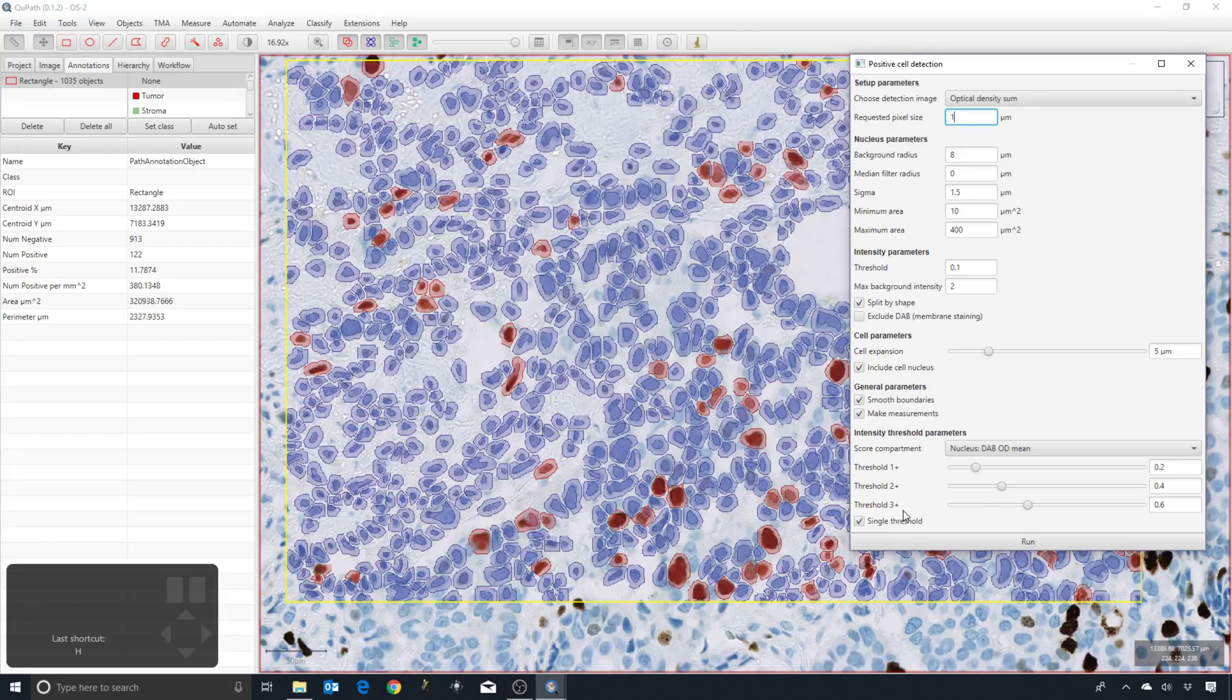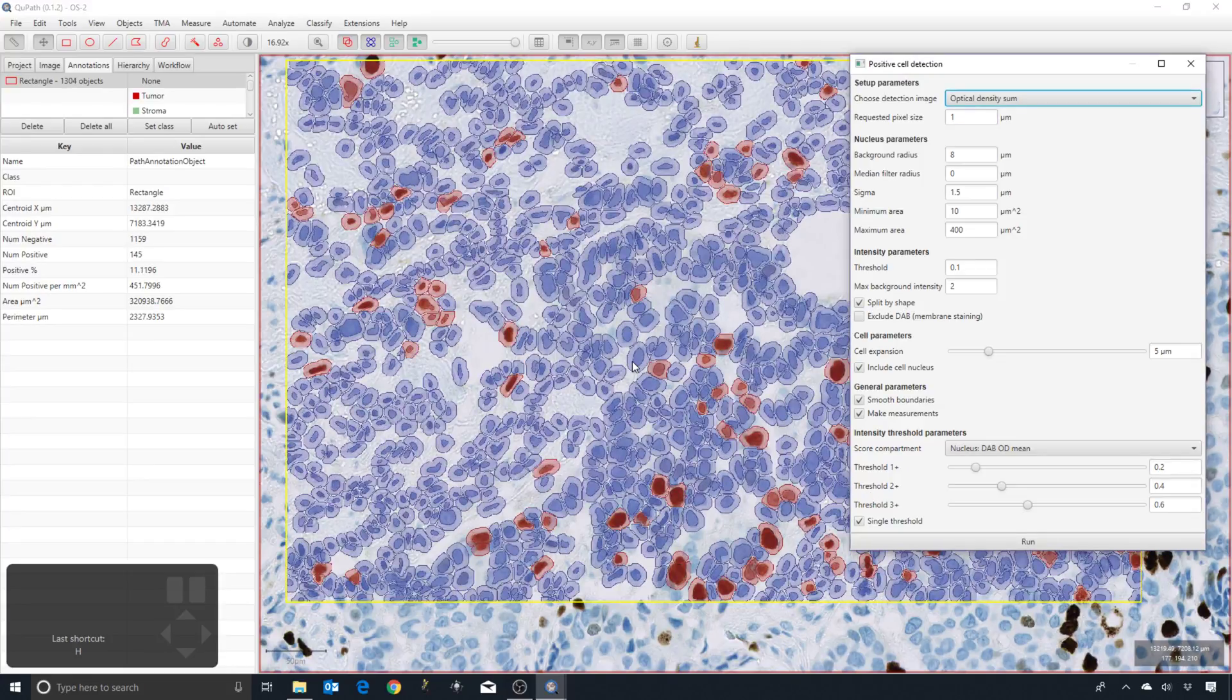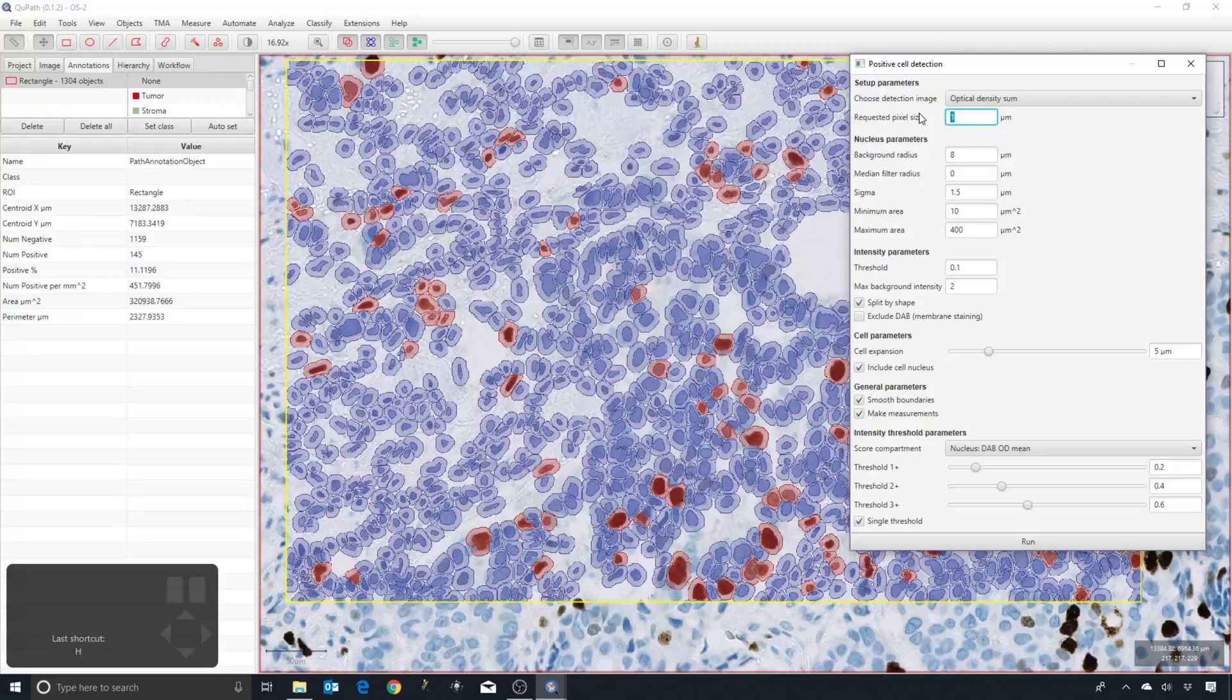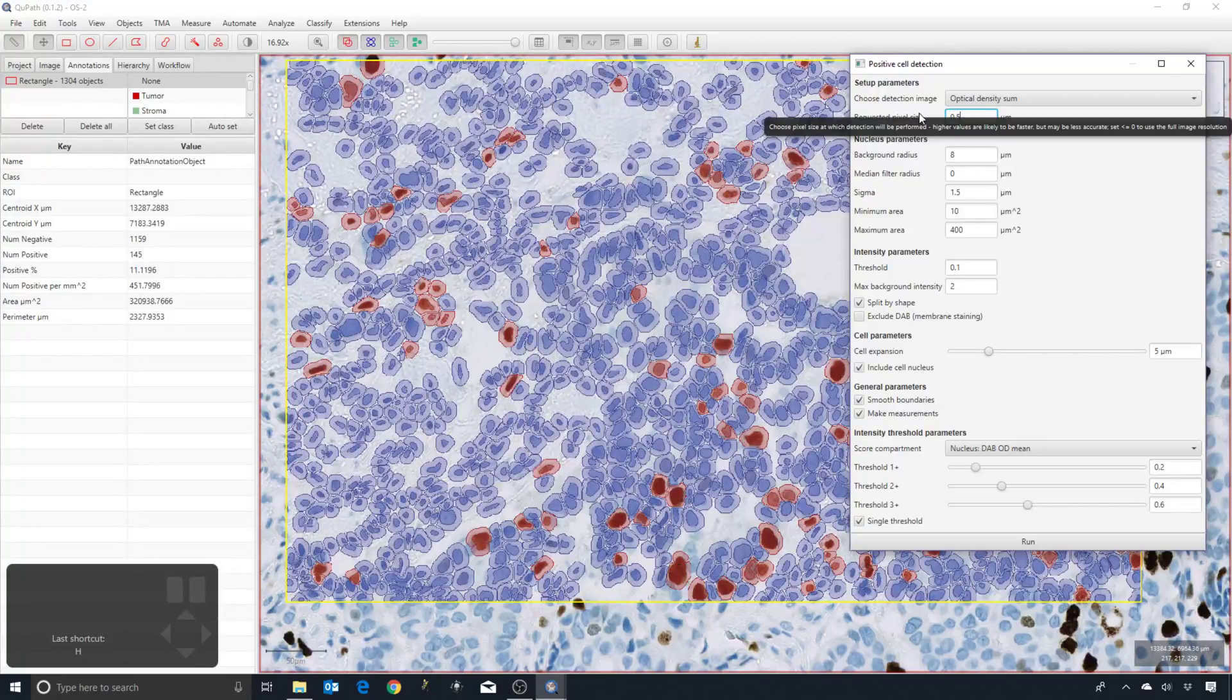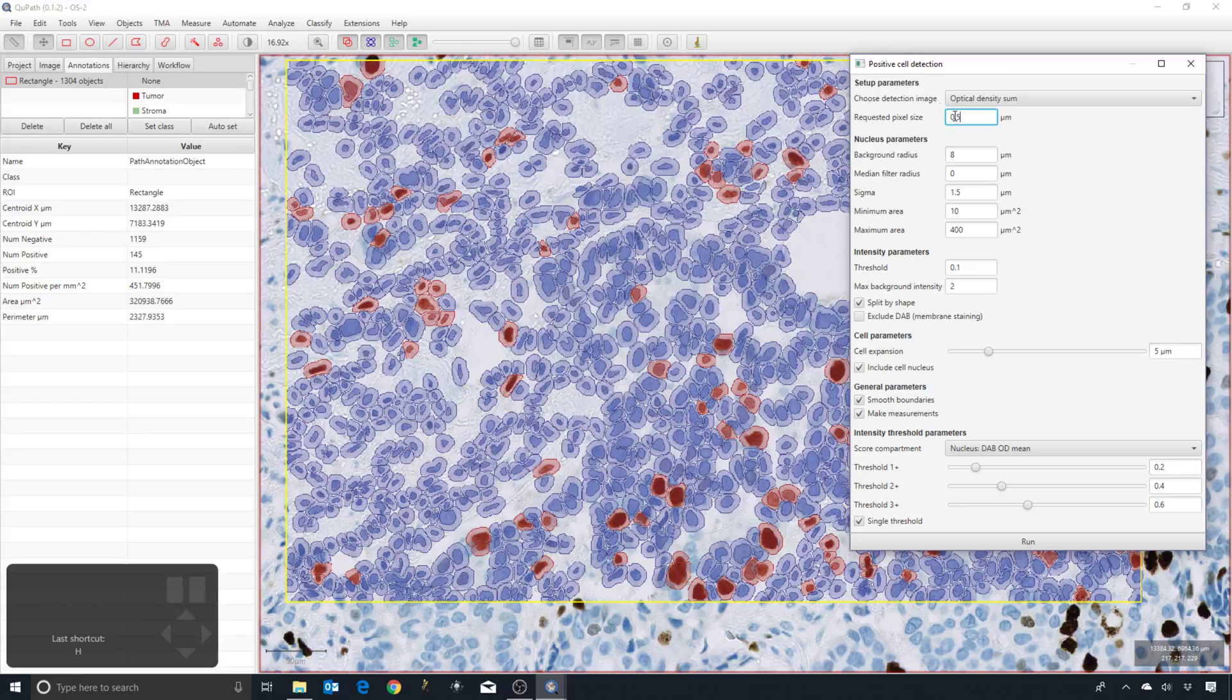I would sometimes run the cell detection, and in live demos I would usually run the cell detection at a pixel size of one because it is substantially faster without losing a lot in terms of accuracy, which corresponds with most scanners to about 10x magnification. But the default is a pixel size of 0.5.